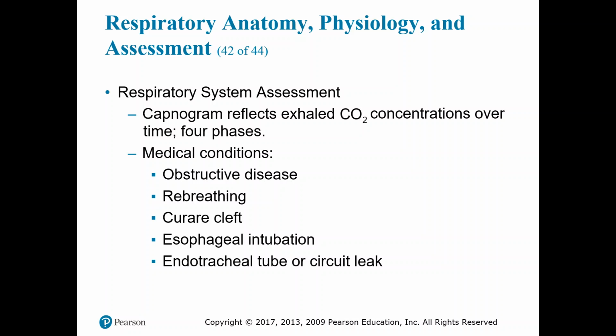So phase 1 is the respiratory baseline. That's the flat line at the base of the graph when no CO2 is present, and corresponds to the late phase of inspiration and the early part of expiration, which is where that dead space is being ventilated. There's no gas exchange in the dead space, so there should not be any CO2 in there.